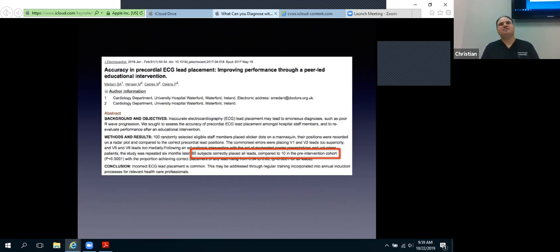Did it note on the first part of the study if they're using their fingers to determine the intercostal space? Or are they just guessing? I think they're just throwing it. They're just guessing. And you know that, if 90% of them are doing it wrong, they're just guessing when they did that. The educational portions there, so, technically, if there's 6 of us in the room right now, that means 2 of us aren't going to do this right 6 months from now.